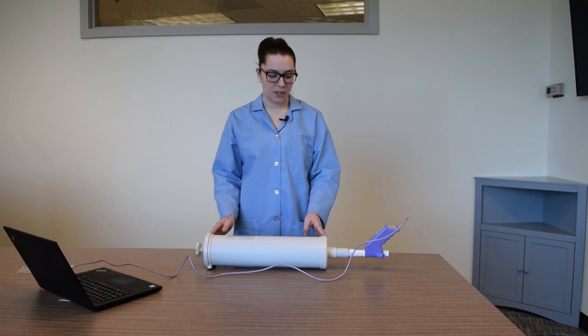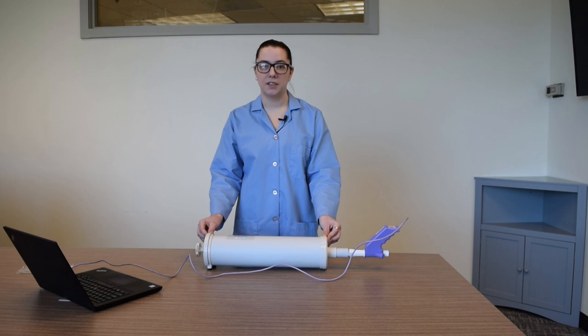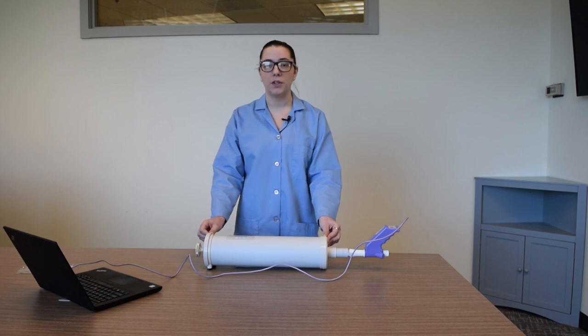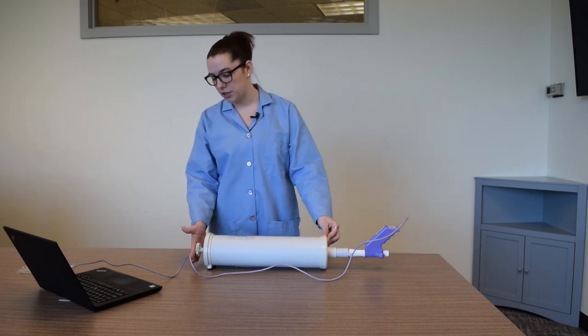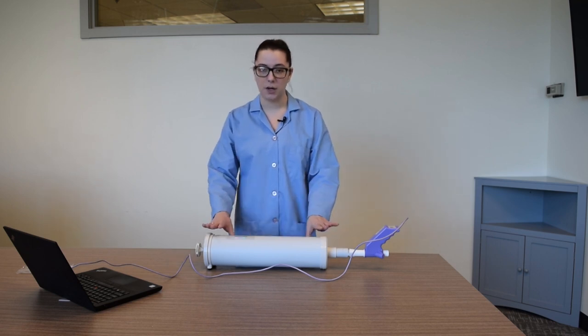The NDD branded syringe, adapter, spirette, and device are designed to fit together. If you're using a non-NDD branded syringe, you may experience problems. Before you begin the test, make sure the plunger is pushed all the way in. You'll also want to be sure your hands do not touch the body of the syringe.